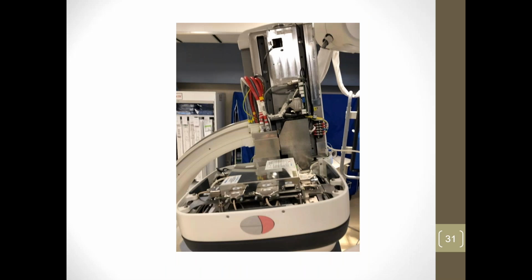And here's a not so happy image detector. Basically, all of this in here is the image detector itself. This is a little smaller format. This is a 20 centimeter detector, and the other one was a 30. They make them as big as 40 centimeters, and with the 40 centimeter detector, you can actually do a full body scan in one pass.